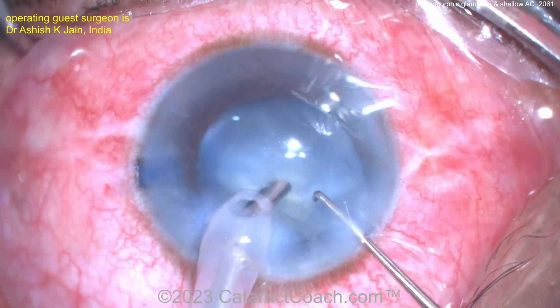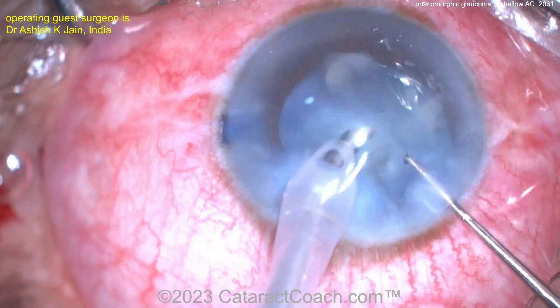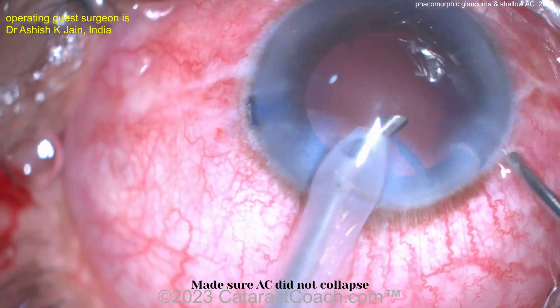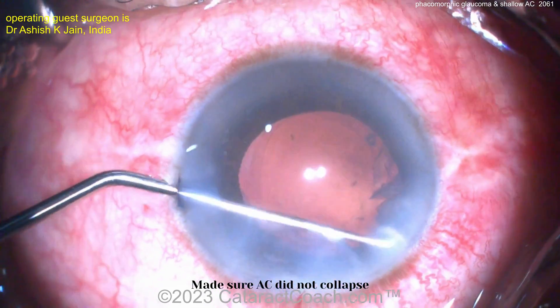Aspirating out the cataract pieces — looks pretty good. There's some HPMC on the cornea to give better visualization. Pieces all come up pretty easily. I like that idea: don't let the AC collapse.